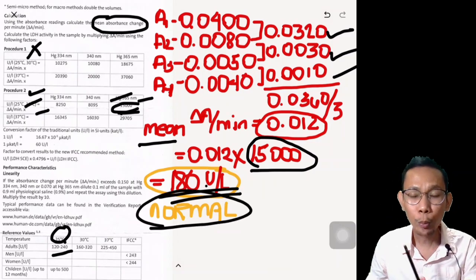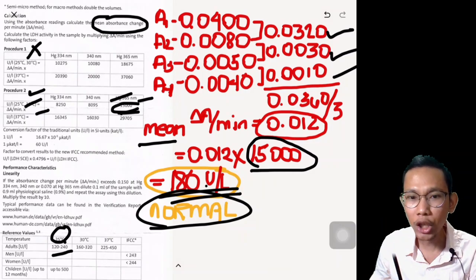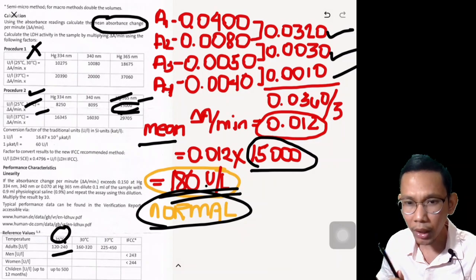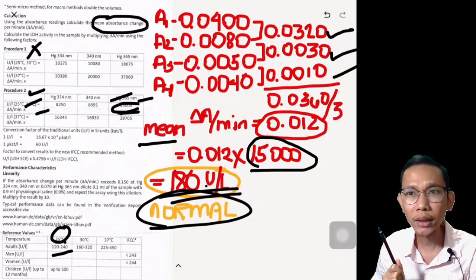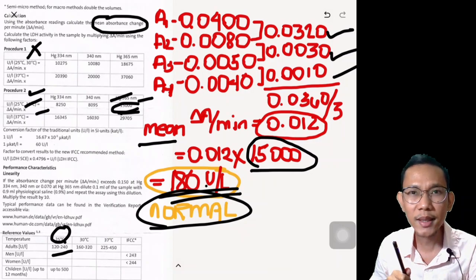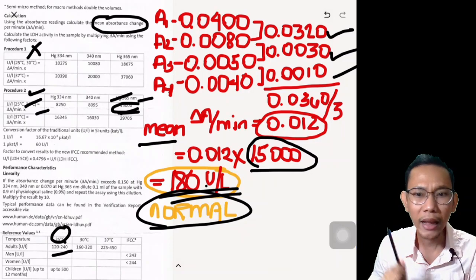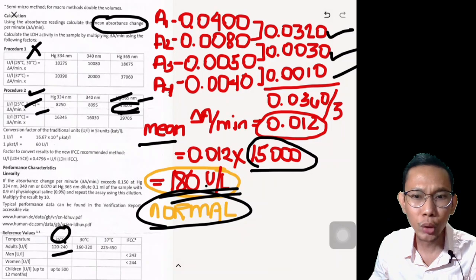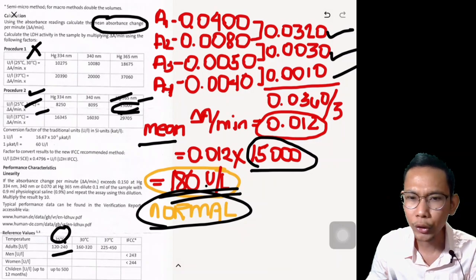So I guess that's how you compute for your CK and LDH. It's very important for you to know the computation because not all the laboratory will be using an automated machine. At my time, I was able to rotate at DRH at Tagum. And at that time, meron mga specific test, mga electrolytes na ginagamit namin is still your spectrophotometer. That's why it is important na at least you have an idea on how to compute, on how to perform. It's just very simple. You just have to follow the instruction. If you're not really sure for this one, please ask me some questions.